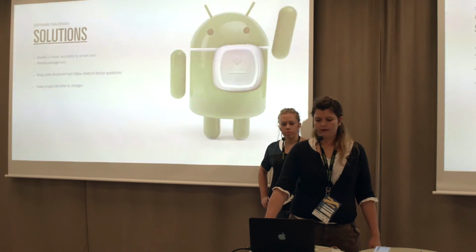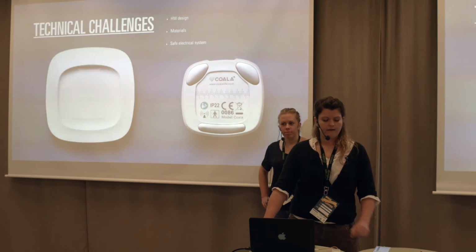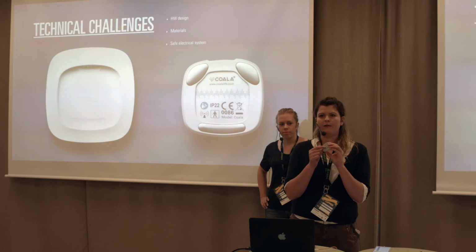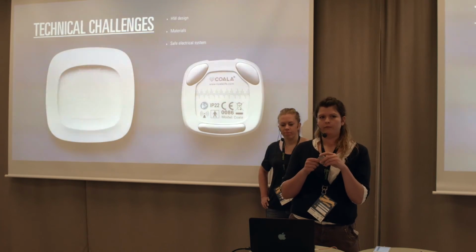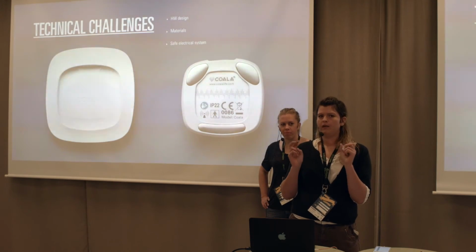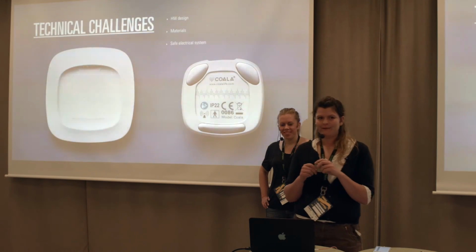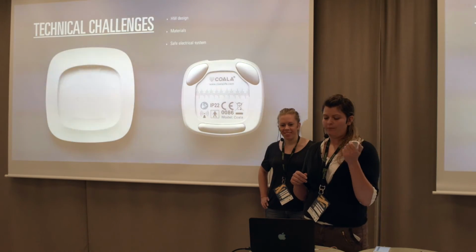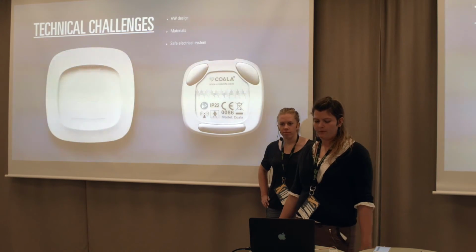And I mean, iOS also had a lot of issues. For example, in this device, you need to have a chip called MFI in order for it to work with iOS, or work for iPhones. So MFI stands for Made for iPhone. So it's a certified Apple product, so that you can use it with Apple products.